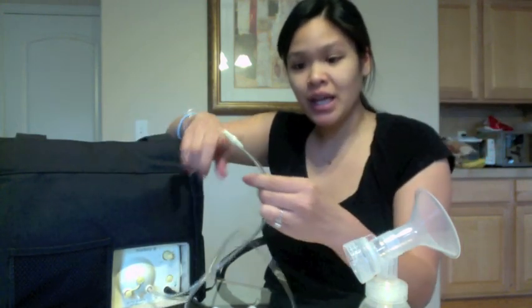As far as turning it off, you just take this thing, and then you just turn it to the left, and then it'll turn it off. But actually, I forgot to mention, once you are done pumping, what you want to do is just pull this membrane off and then just let it sit maybe a couple minutes or so. Usually when you pump, there's lots of moisture, and sometimes it can condense in the tube. It's not milk or anything, it's just moisture. And so by letting the tube stay connected to the pump and keep going, it'll get everything in here dry. So you want to make sure everything's dry. Once everything's clear, you don't see any moisture or anything in it, then go ahead and turn it off.